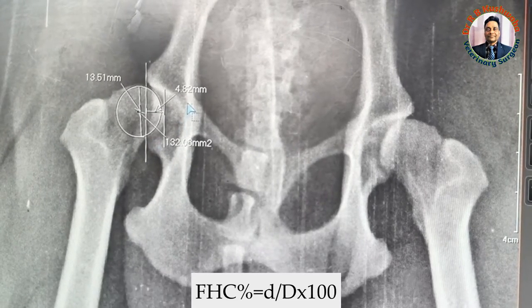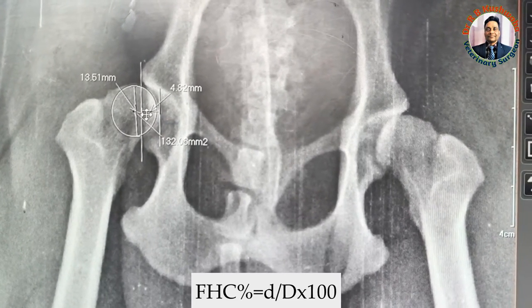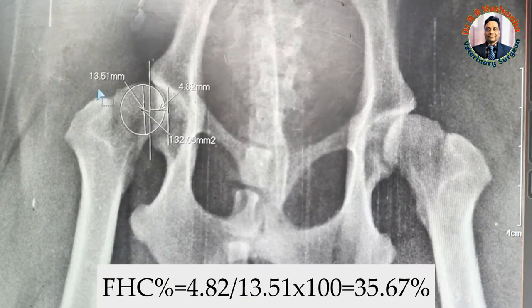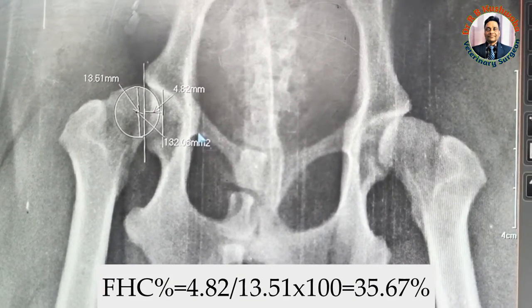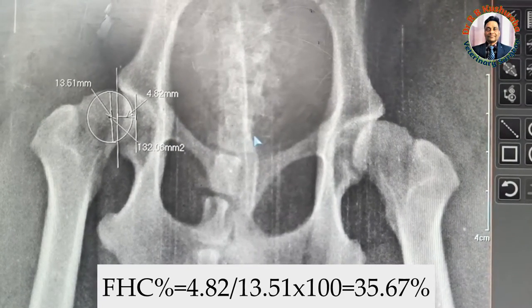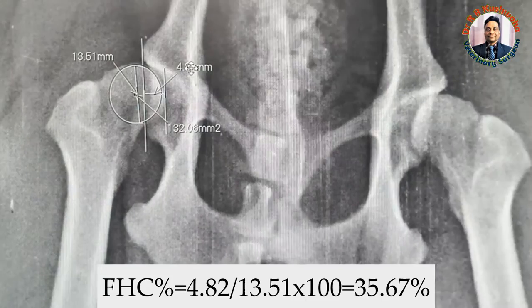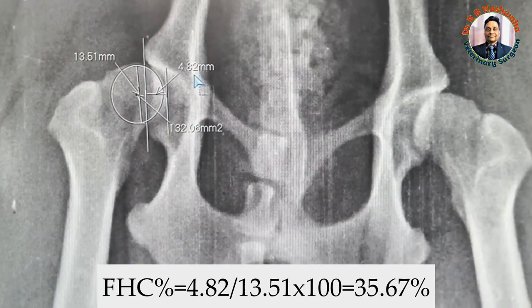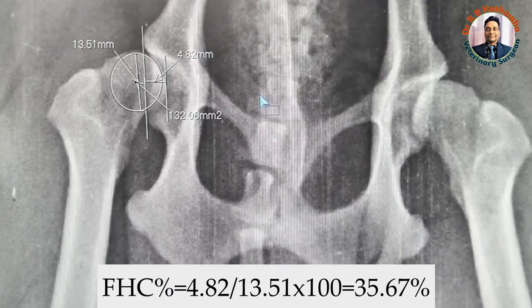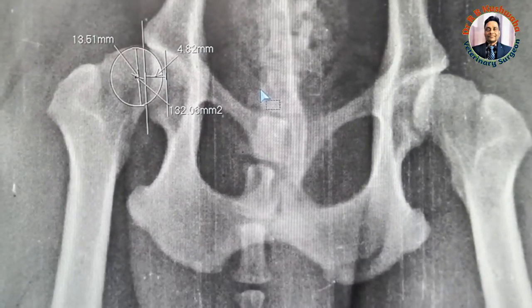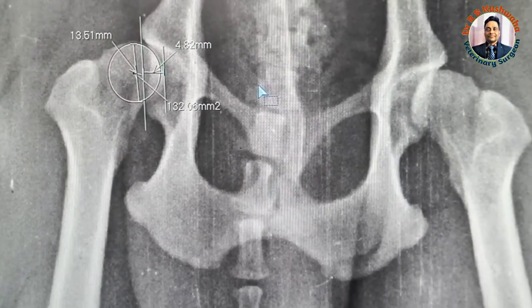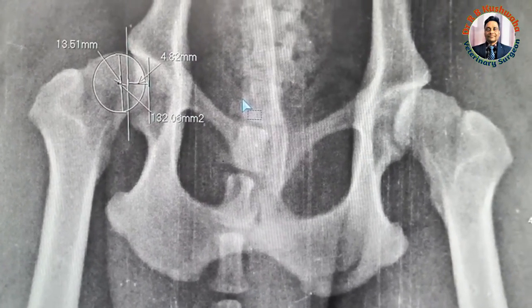The next step is to divide this distance — 4.82 millimeters — by the diameter of 13.51 millimeters, then multiply by 100 to get the percentage. Upon division, 4.82 divided by 13.51 gives a value of 35.67. This means the femoral head coverage percentage in this case is 35.67%, which is very much less than the normal 60%.